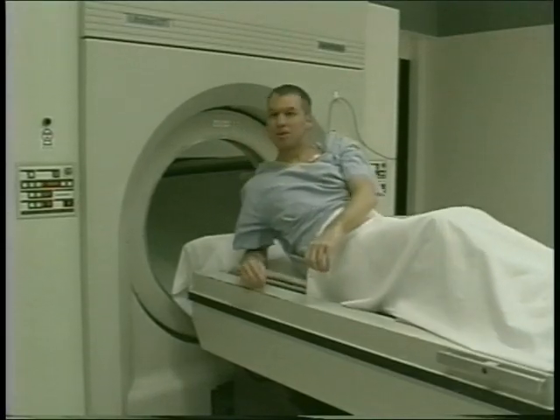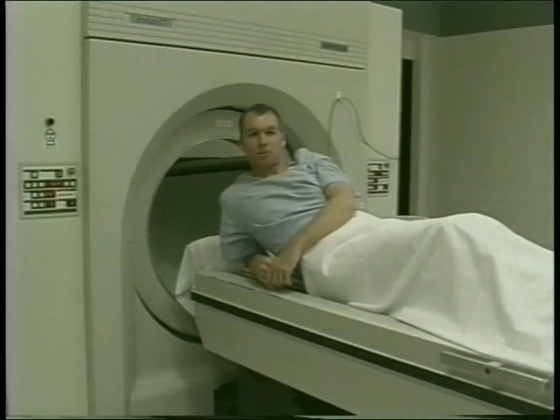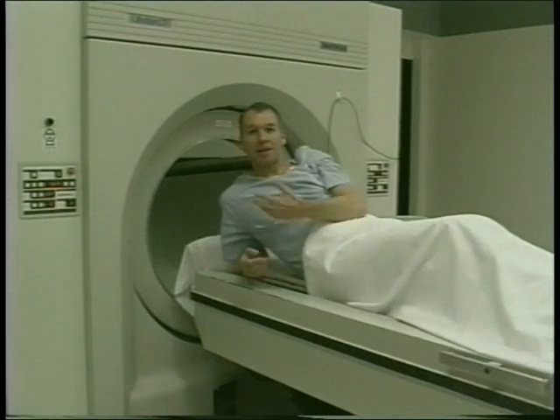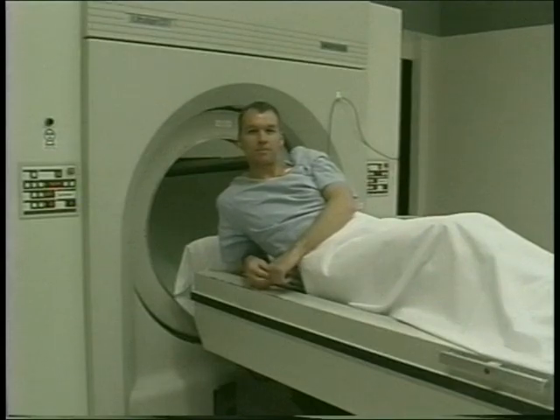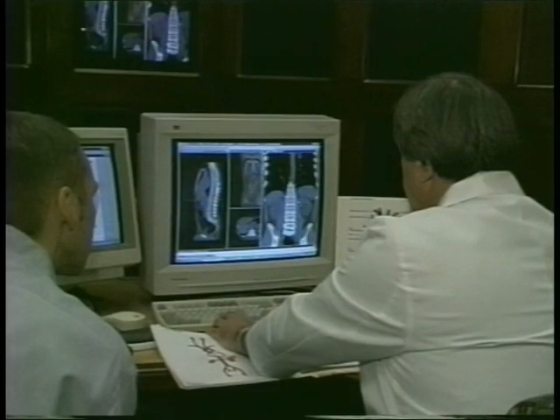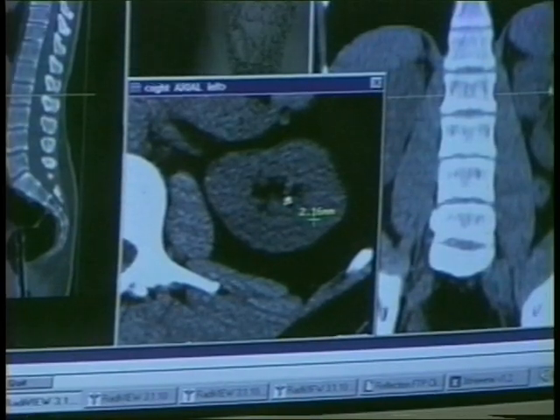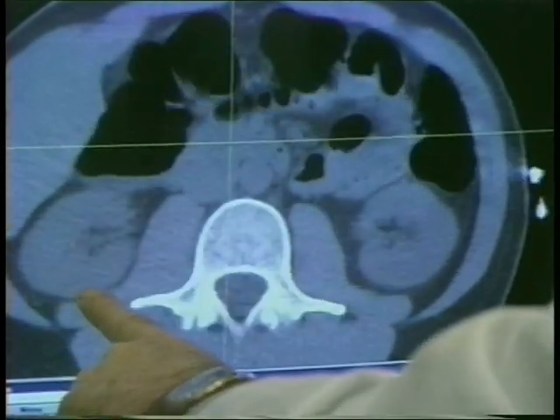It's a bit like emerging out of a huge washing machine. What's happening now is the pictures will be processed. It takes about an hour. This is the nerve-wracking time, and then I'll get to see the 3D images inside my body. The moment of truth is not for the faint-hearted. We're looking here at the kidneys, and the first thing we see is that you have a kidney stone. Thankfully, not a deadly disease.